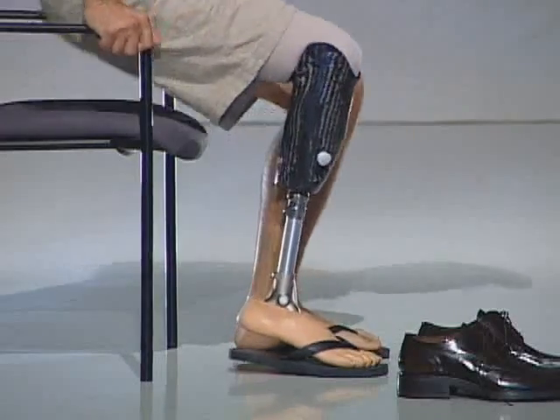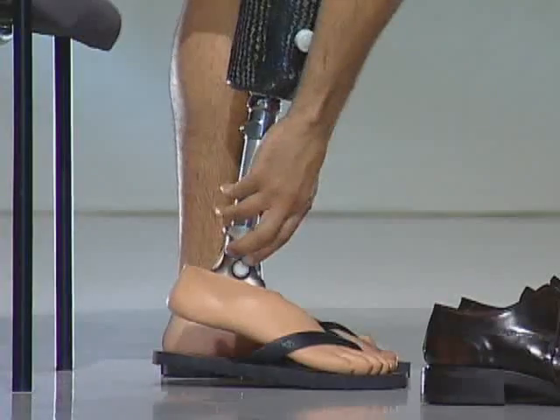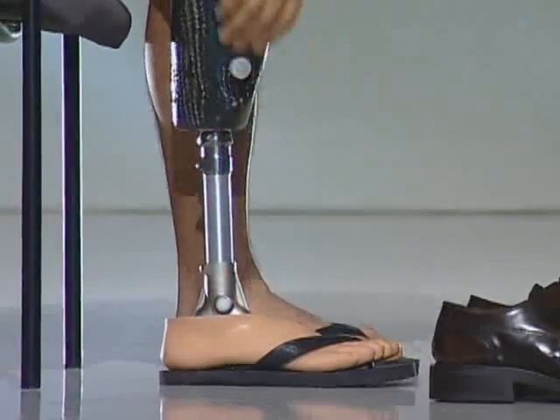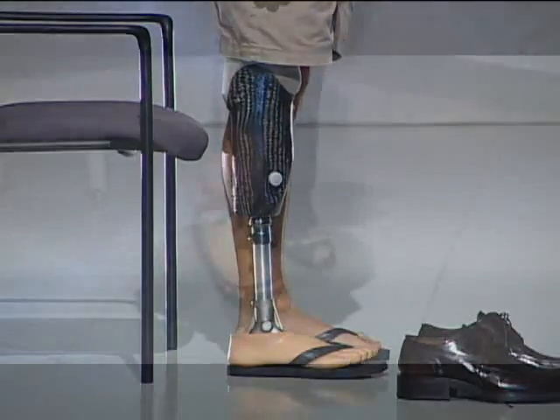Press the release button on the ankle mechanism and put pressure onto the ankle to re-establish a vertical pin.